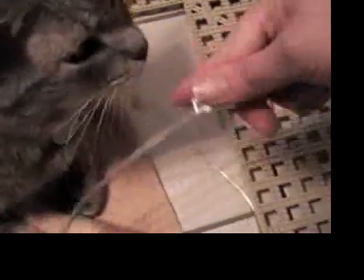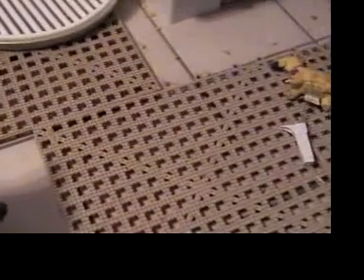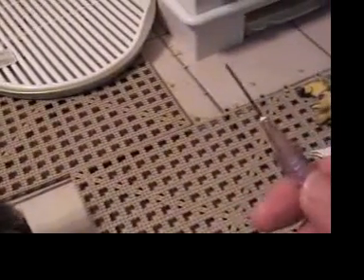Aww. And actually she's done already. She only gets 50 milliliters. So she's all done. I'm careful not to touch the needle to any surface. You don't have to recap the needle. You do risk poking yourself if you do, obviously.